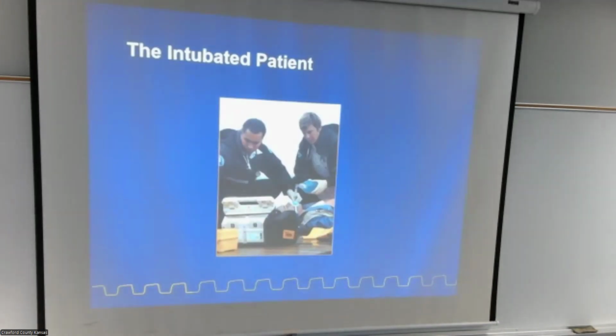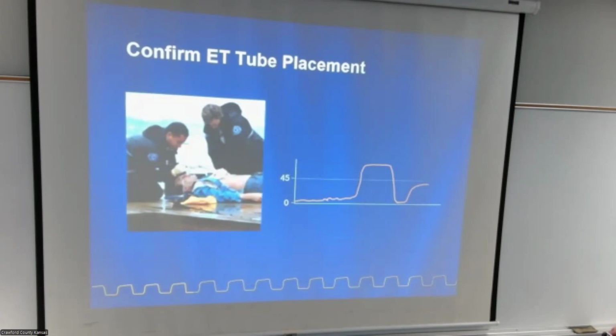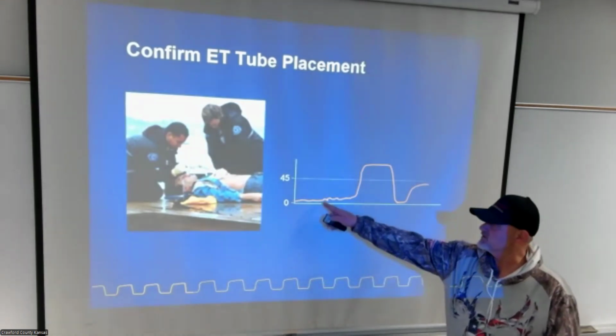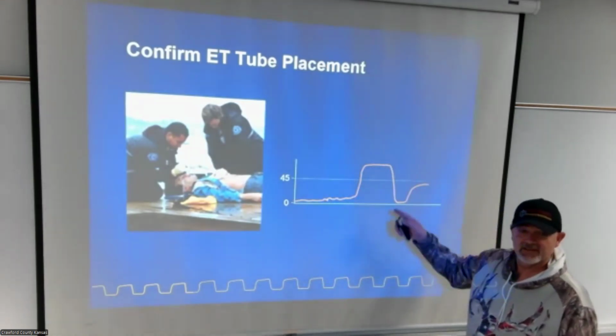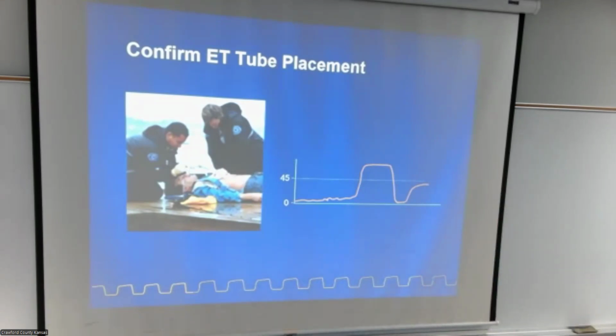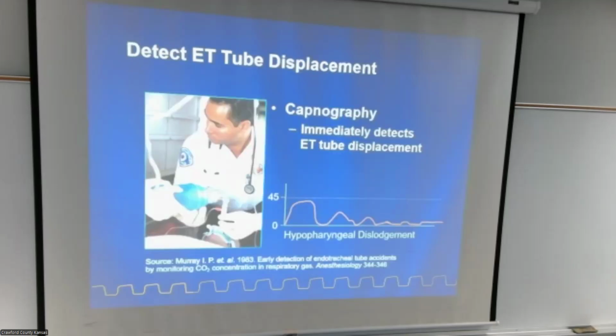Now, our intubated patient on CO2, this is where I think it comes into play more effectively than anywhere else. This is a great thing when you're the one intubating the patient, when this little squiggly line does this number, when you couldn't see the vocal cords to begin with because of blood and everything else and puke. That's a great thing to see. That just takes a weight off your shoulders, even still today. That lets you know you're confirmed and you're in place.